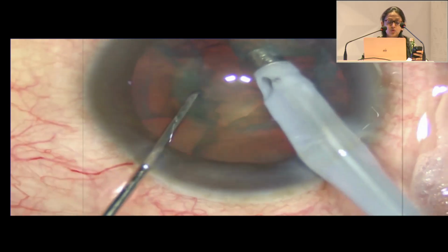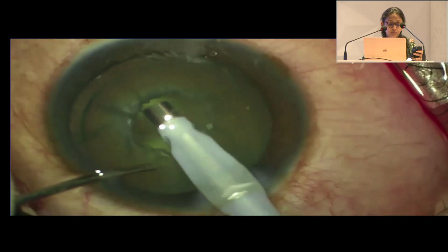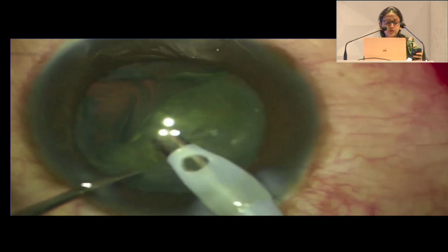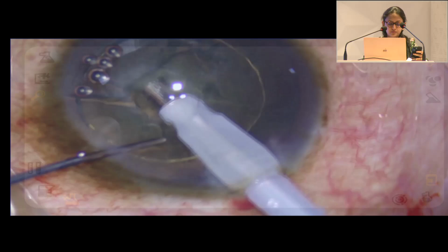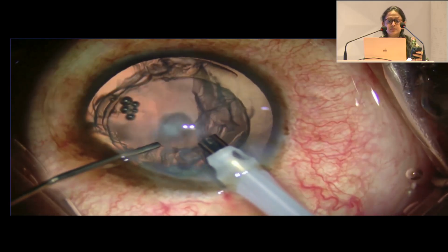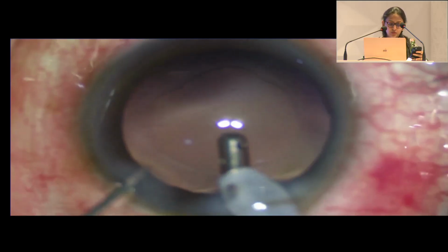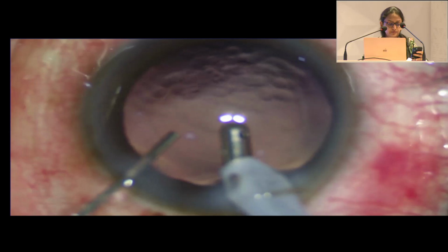Ideally, we want to do a slow motion phacoemulsification with low aspiration, low infusion, low vacuum parameters. The low vacuum and aspiration rate maintain a stable anterior chamber, and the low infusion drives less fluid around the lens. Inject viscoelastic from the side port whenever the phaco or irrigation aspiration probe is withdrawn from the eye. This helps to keep the anterior chamber well formed and prevents forward bulging of the posterior capsule throughout the surgery. Any major fluctuations in the anterior chamber should be avoided.